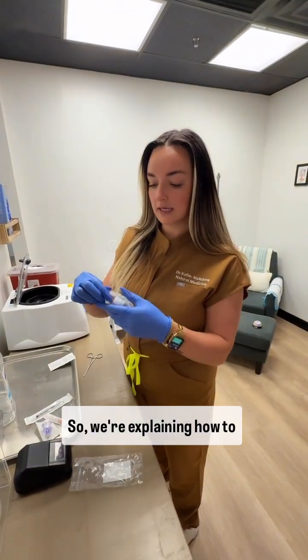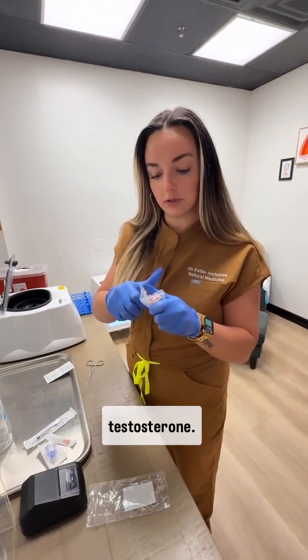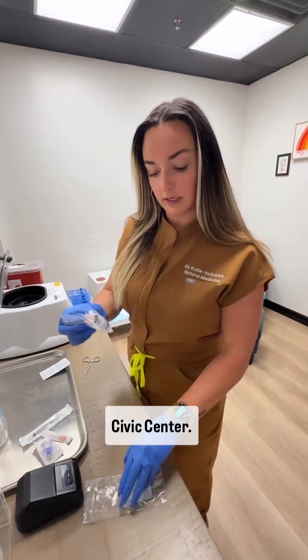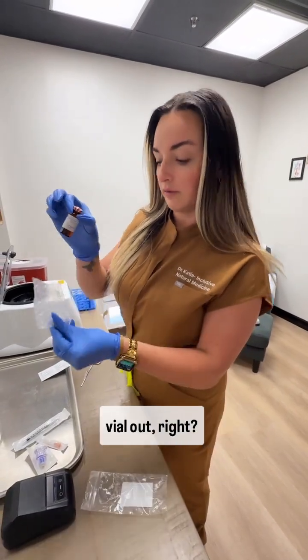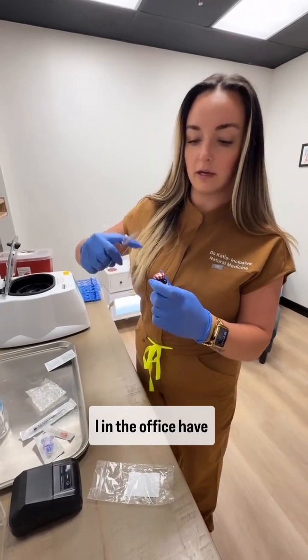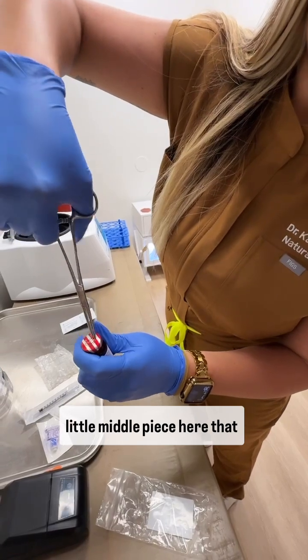Hi, all right, so we're explaining how to draw up and administer your testosterone. We get our blend from a compounding pharmacy called Civic Center. So you'll get your baggie. Your dosage will be on the front label, but you pull the vial out of the bubble wrap, obviously. You can use a pair of scissors. In the office, I have hemostats, but there's this little middle piece here that we'll take off.